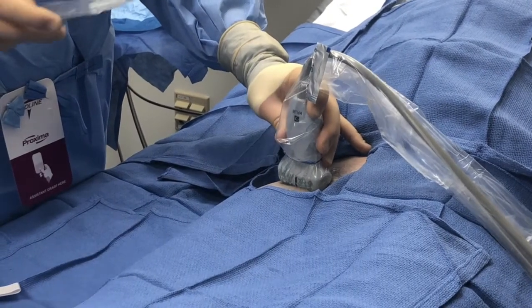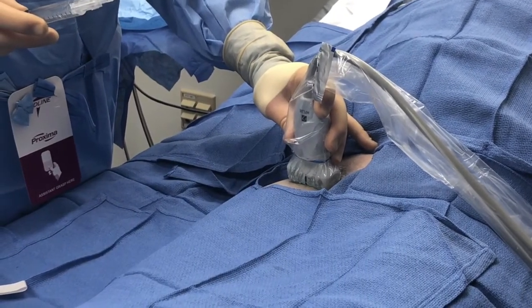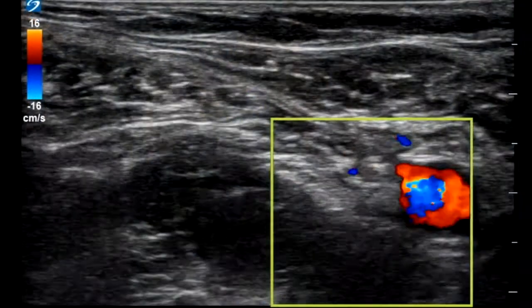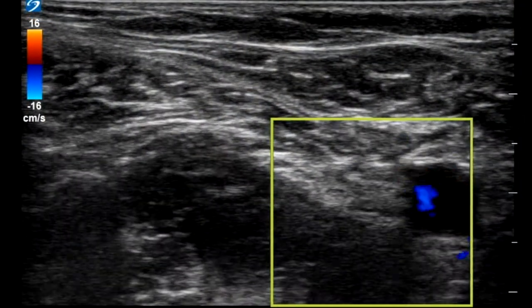The patient is prepped and draped with full sterile technique. A high-frequency linear transducer is placed at the level of the femoral crease. Check the target area with color flow to ensure it is free of any vascular structures.